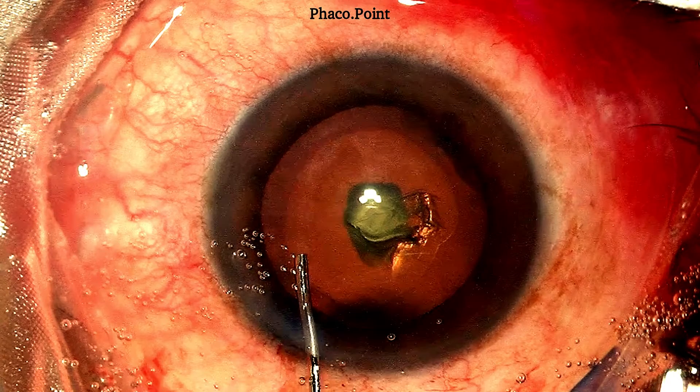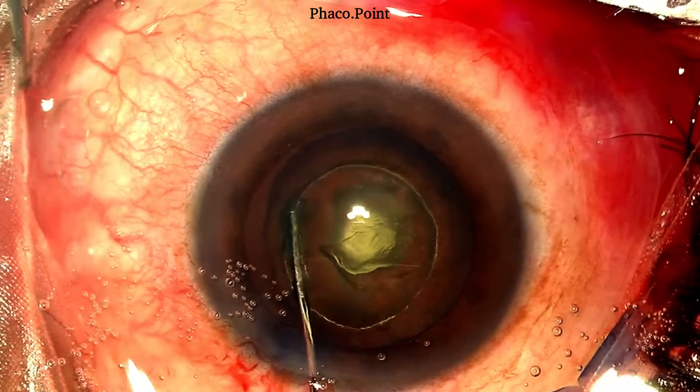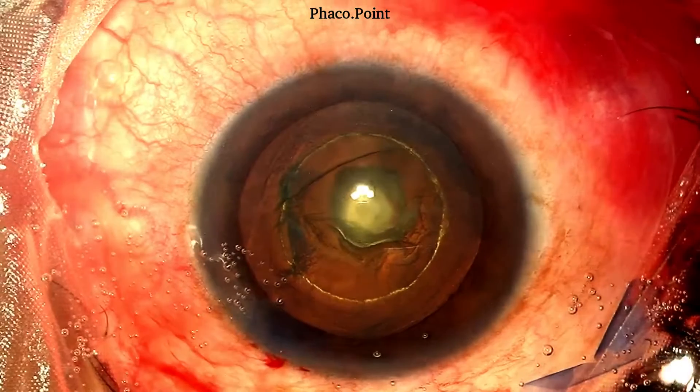The next step is hydro delineation. In order to successfully perform this, the hydro cannula is buried into the substance of the nucleus and a jet of fluid injected. This brings about the delineation of the endonucleus without disturbing the epinucleus and cortex, minimizing the risk of creating a posterior capsular rupture during this step.